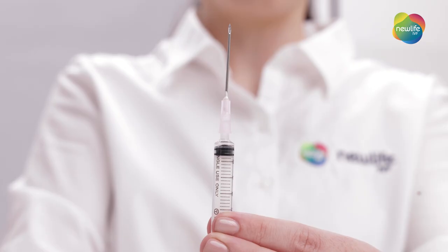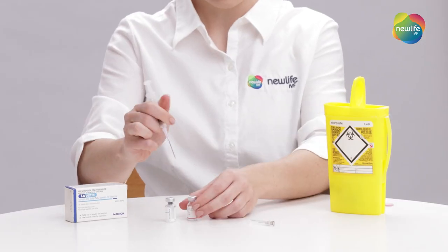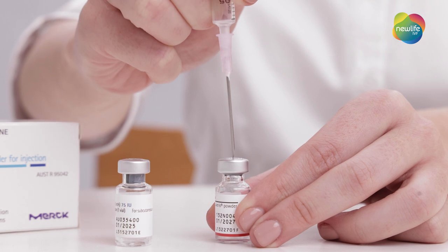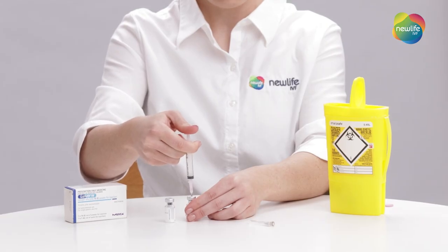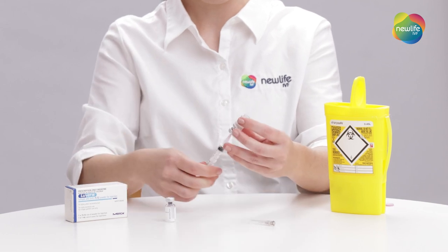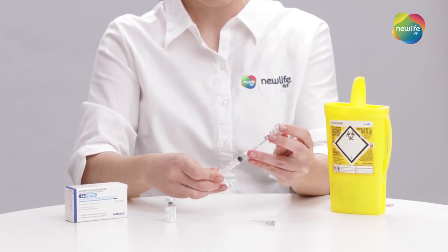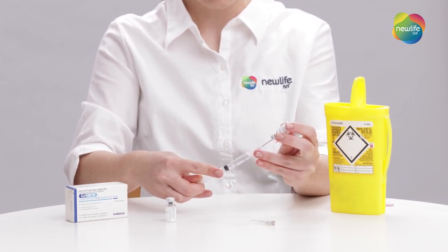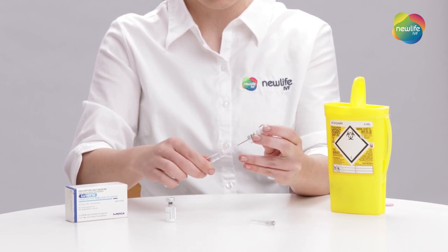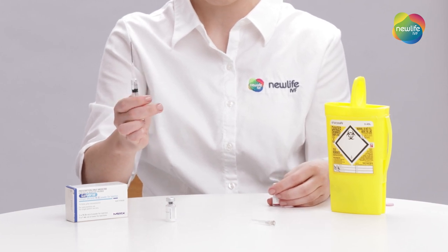Now, holding your syringe upright, draw one mil of air into your syringe and insert the needle into the water vial directly into the rubber centre and expel the air. With your needle still in, turn the vial upside down and pull back on the plunger to draw out as much of the water as possible. Be careful not to remove the needle from the vial during this process. Remove the needle from the vial and then push out any excess air.